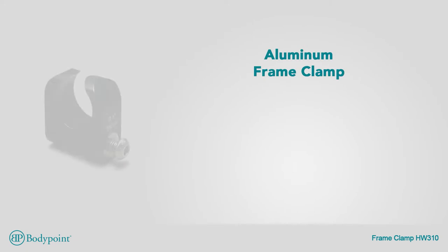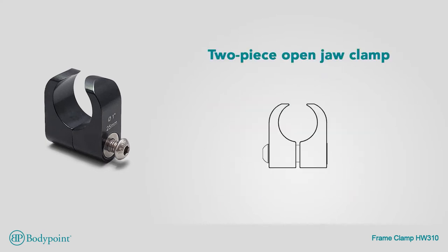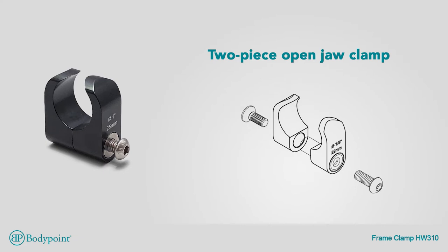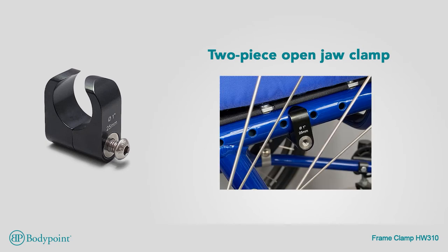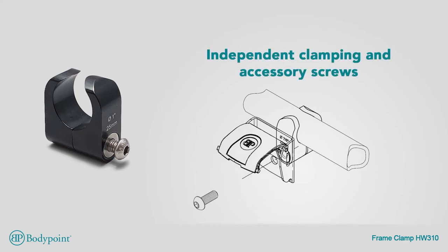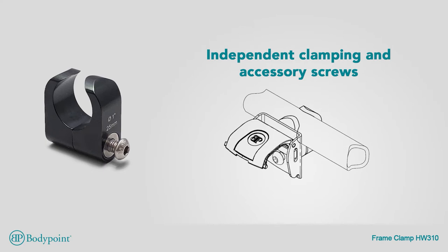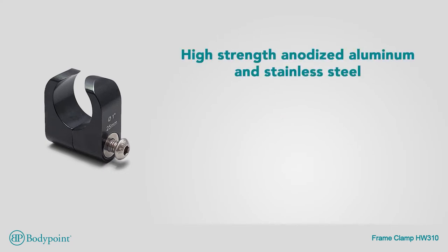Clamp around obstructions with our aluminum frame clamp and put your postural support where you need it. Unlike U-shaped and one-piece clamps, this two-piece open jaw clamp fits even under seat upholstery or seat back gussets, letting you mount exactly where you want. Independent clamping and accessory screws make it easy to change mounted accessories without losing the clamp's position. The frame clamp is available in sizes to fit 25 millimeter or 22 millimeter tubing. Made of high-strength anodized aluminum and stainless steel, it ensures a long life in the most demanding environments and can support 350 kilograms.